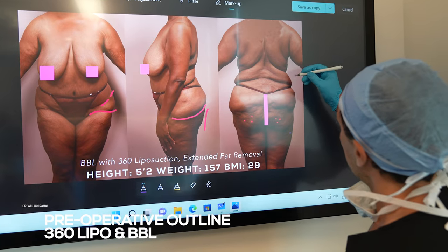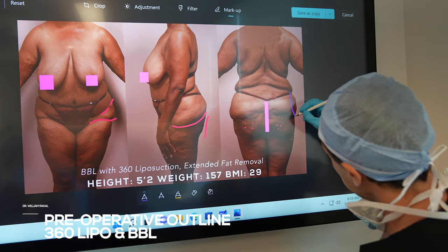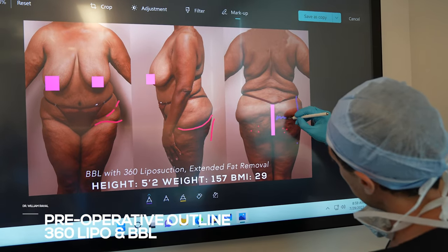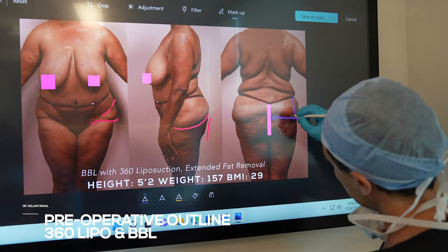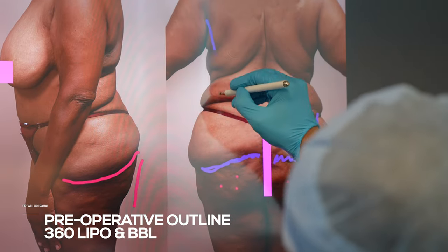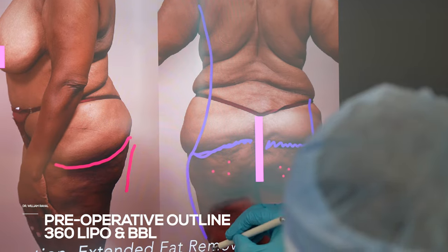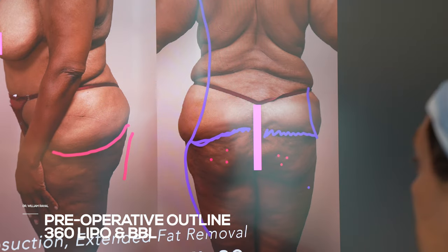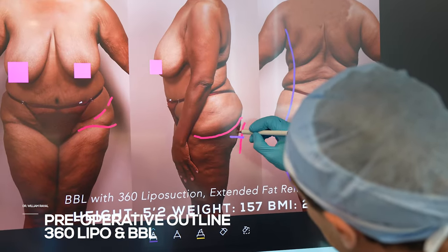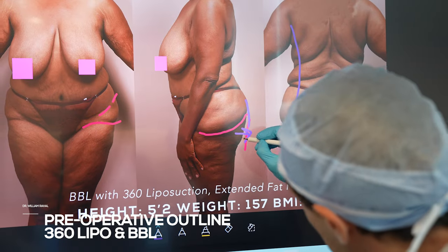So what we have to do is we have to shave this down a little bit. We have to really add a lot of fat here to improve that — shave that down, expand this, add volume there, and get this to come out here like this.